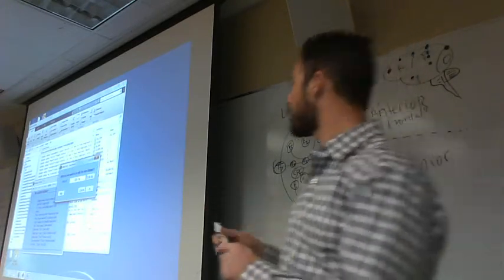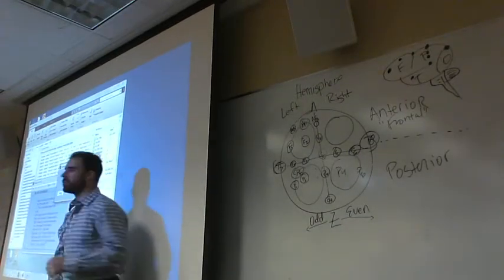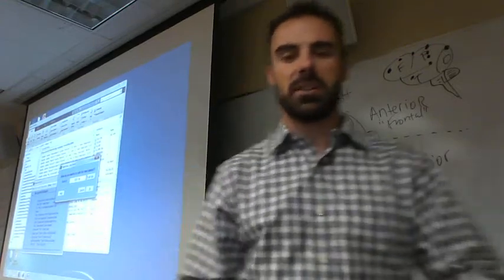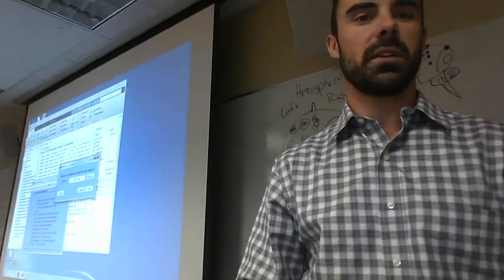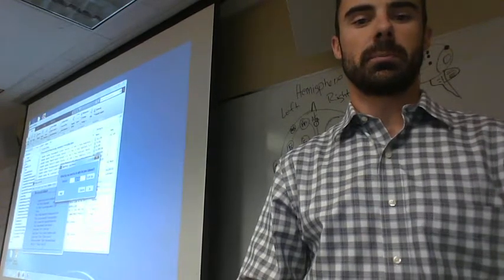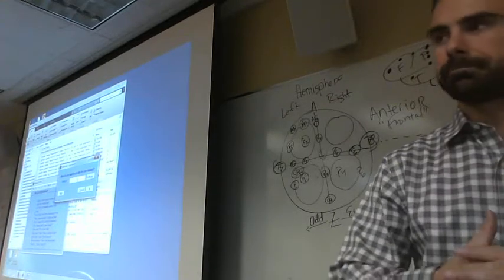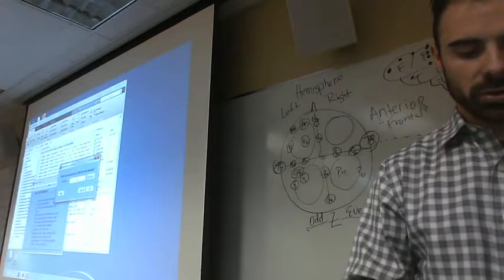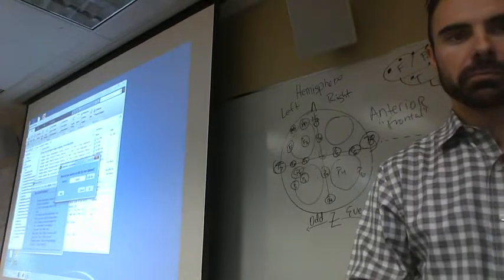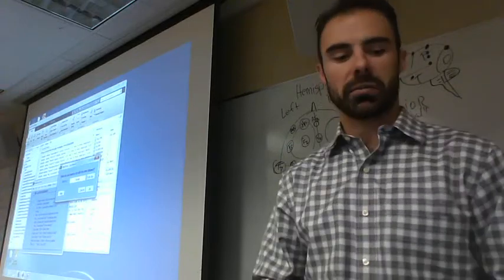All right, looks like our analysis is moving along. It's imported the data. It asked us, what do we want to do with this data set? Do we want to name it as BDF? I'm going to say let's not. Let's instead call it re-ref. That way we know that it's been re-referenced, and we know that it's referenced to our mastoids.